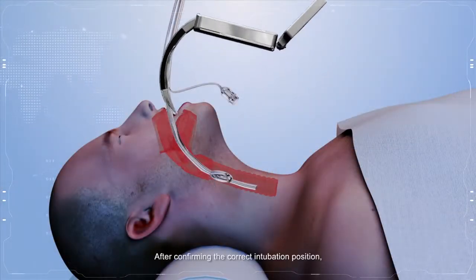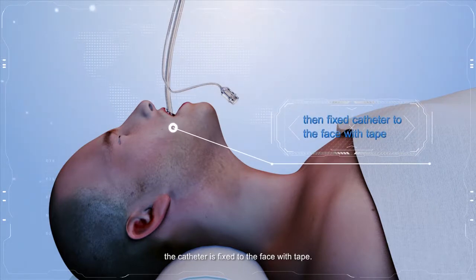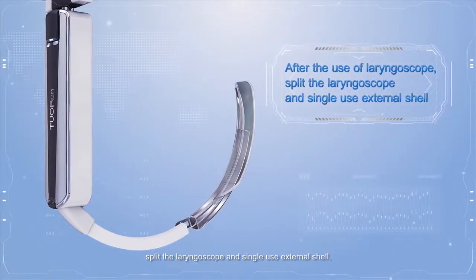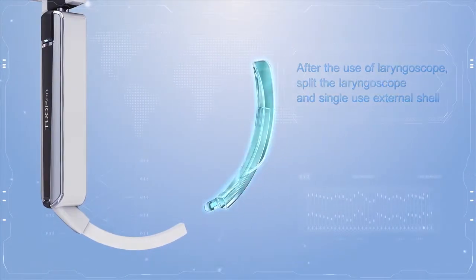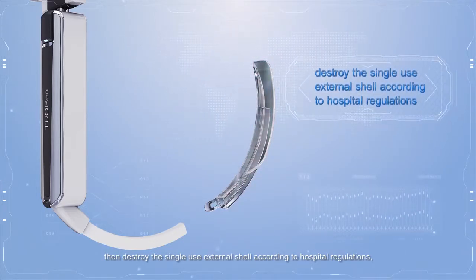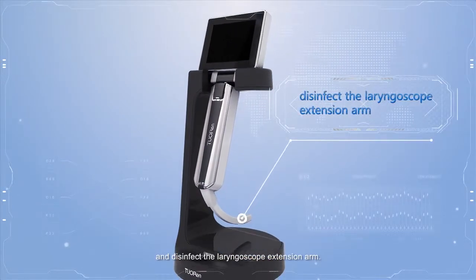After confirming the correct intubation position, the catheter is fixed to the face with tape. After use, split the laryngoscope and single-use external shell. Destroy the single-use external shell according to hospital regulations, and disinfect the laryngoscope extension arm.